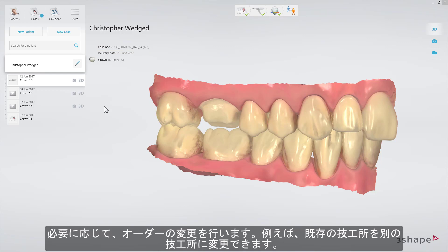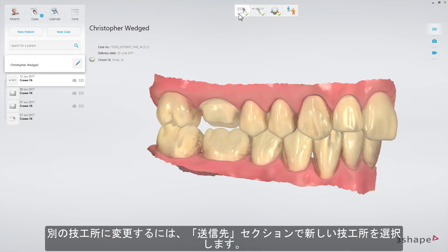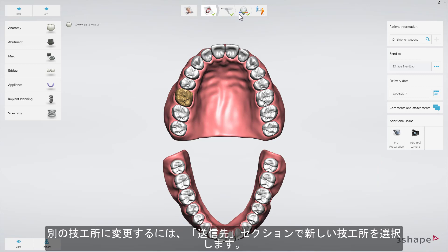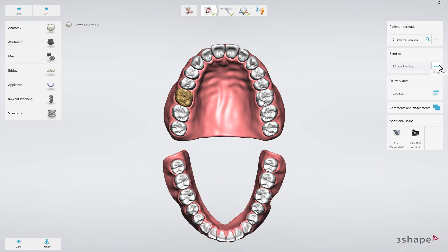Now perform the changes you need. For instance, change the lab to a different one. To do that, select a new lab in the send to section and choose a different lab.